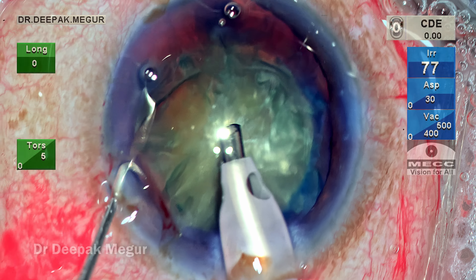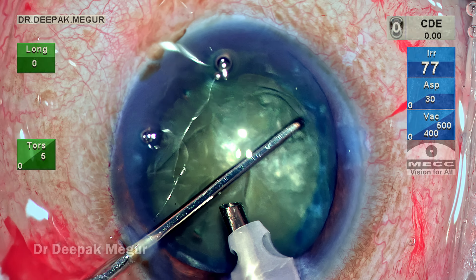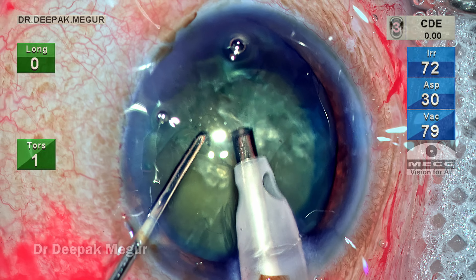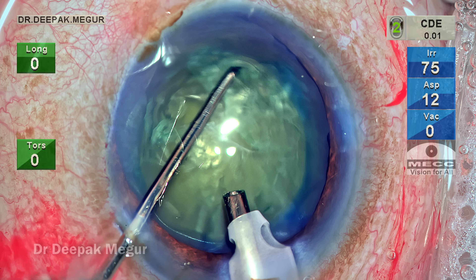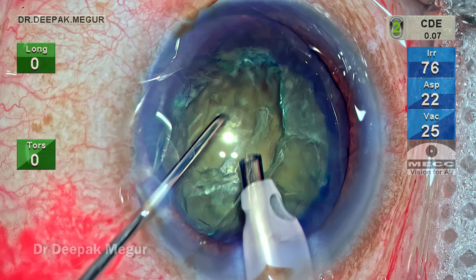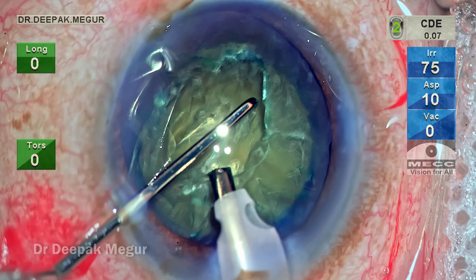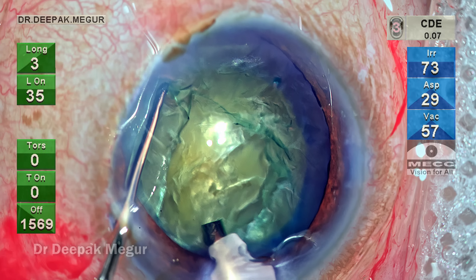As the superficial epinucleus is being aspirated, remember we're dealing with an eye that has a potentially floppy bag. Nucleus division maneuvers and aspiration technique must be gentle, keeping in consideration the laxity of the zonules. The dividing maneuvers must be as gentle as possible.